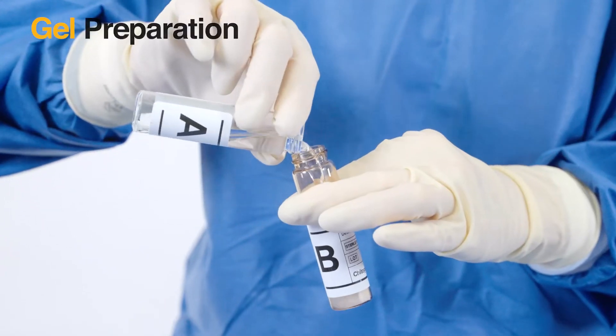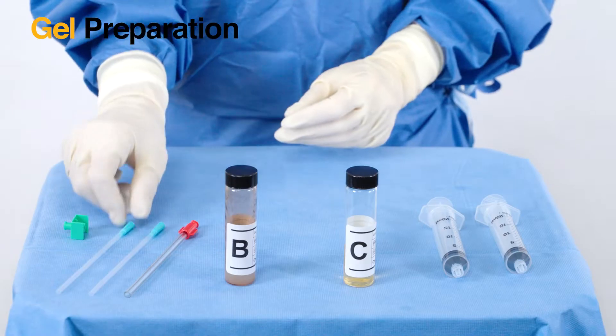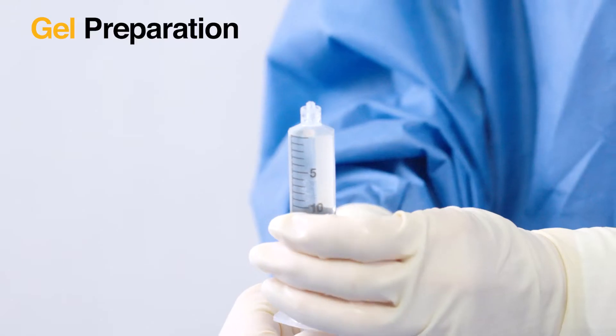First, pour A into B and shake the new AB solution for 20 seconds. Using the first mixing cannula, aspirate 11ml of the AB solution into the first syringe.